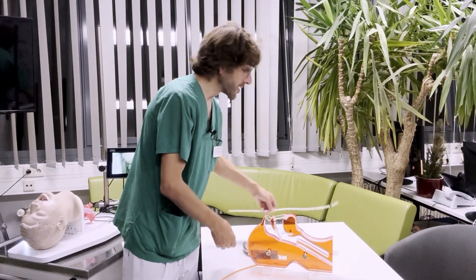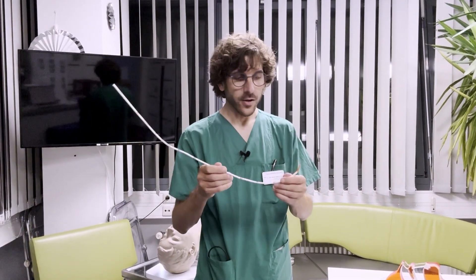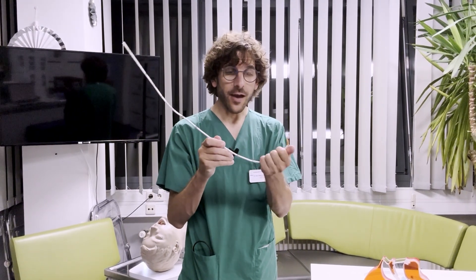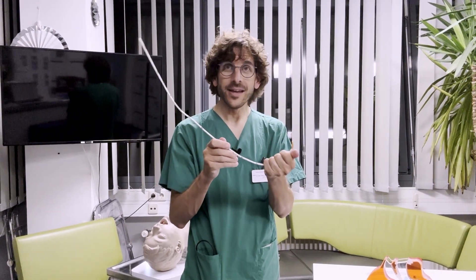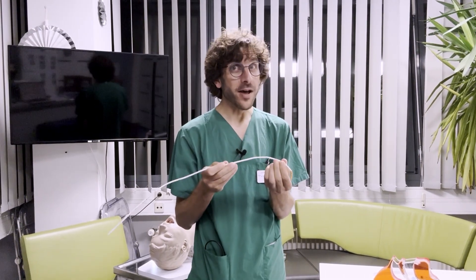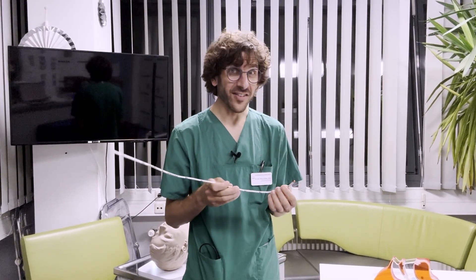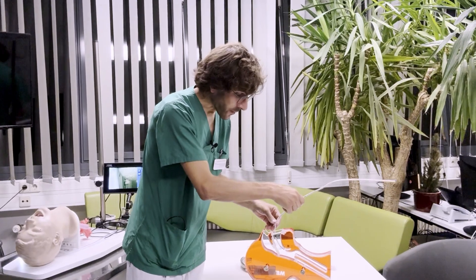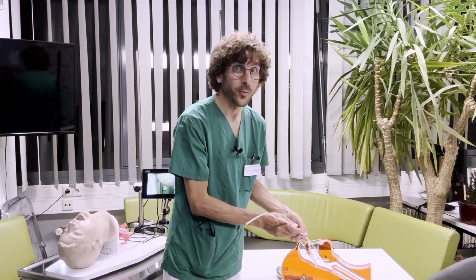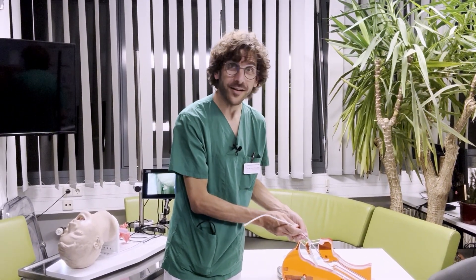You will never be able to do this with a rigid device like a stylet, or in this case the s-guide, because the curve that you have in here is just rigidly there and you can't turn it around. You can only turn the entire device. Remember the tongue is still there, so once we've passed it we cannot turn it — because we would have to cut out the tongue.